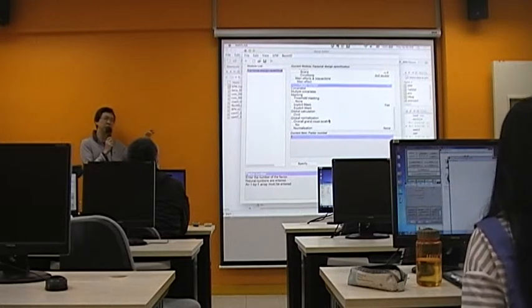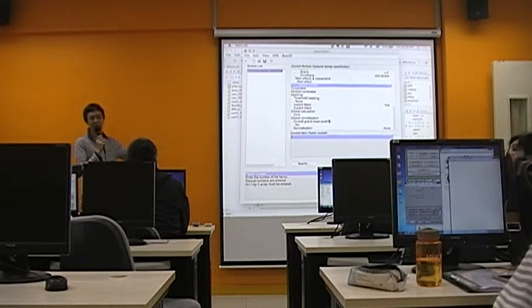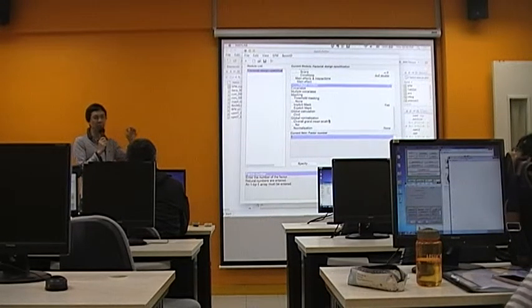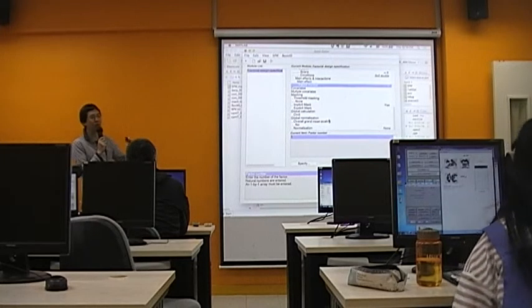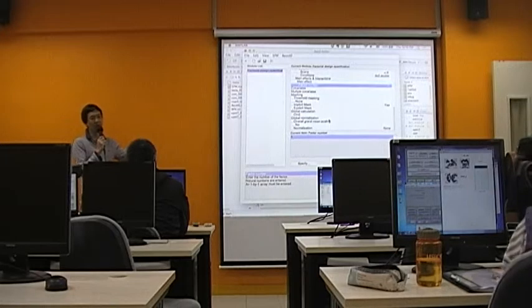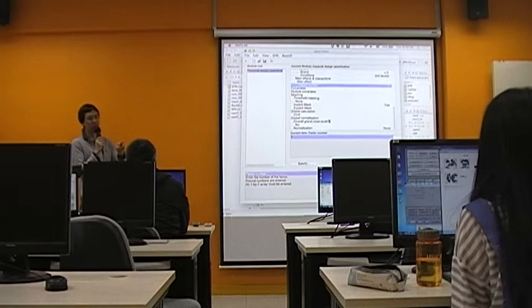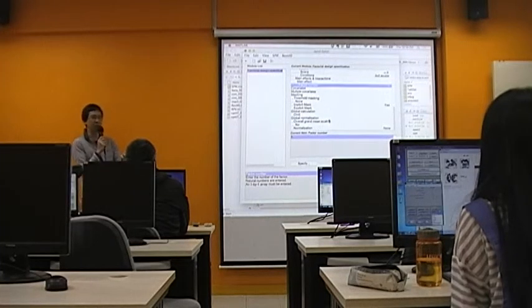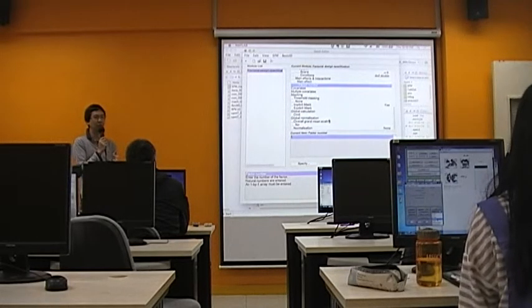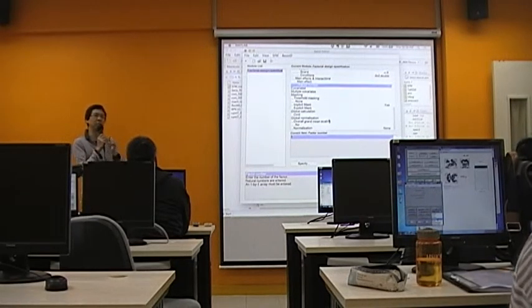Usually we don't use a contrast image, because if you do a contrast already, you are asking some questions there. Normally, with a flexible factorial design, we use a regressor-specific beta, or regressor-related beta. If you have a factor with 2 levels, then you have 2 betas. So for each level of the factor, you have one corresponding regressor, right? So for each regressor, you have a beta value or beta image. So you use that beta as an input.